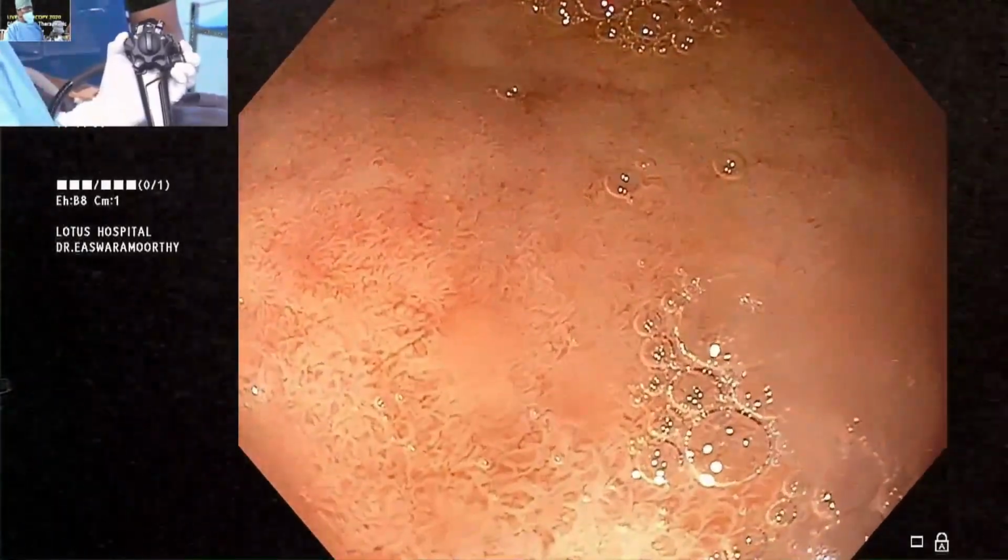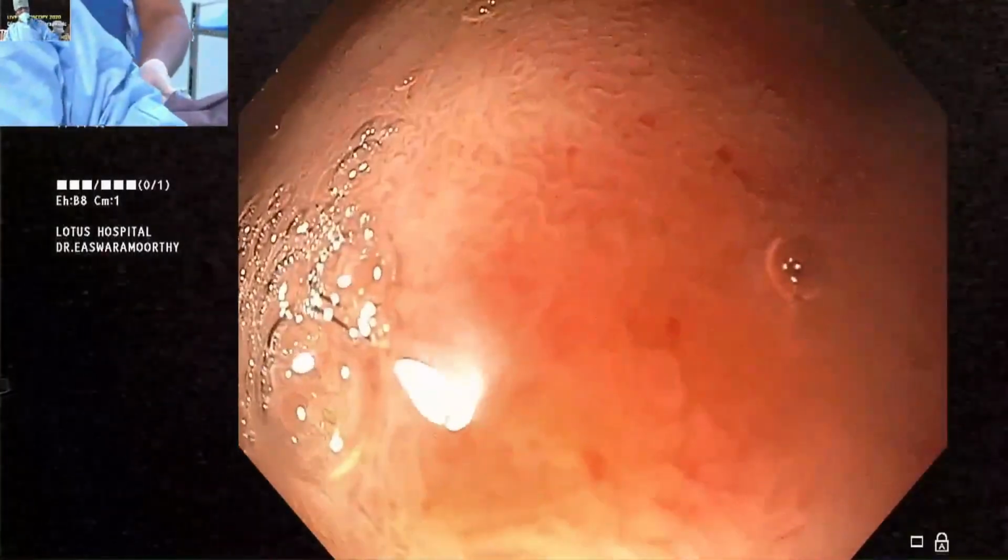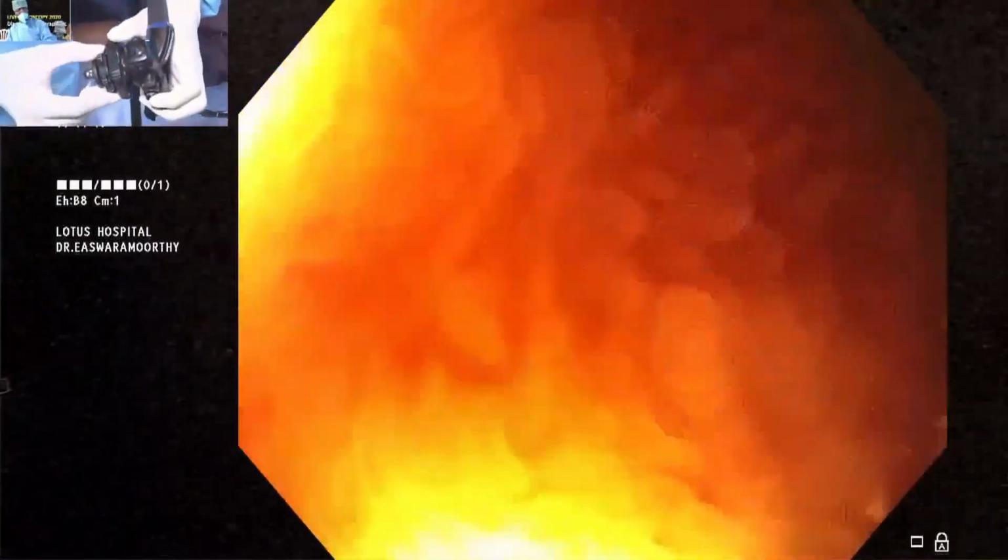For that, the body movement is very important. I turn my body like, see, for example here, and also small wheel away from me. I will be able to see not only the posterior wall, but also I may be able to progress further into the D2. So that's another important thing you'll see.